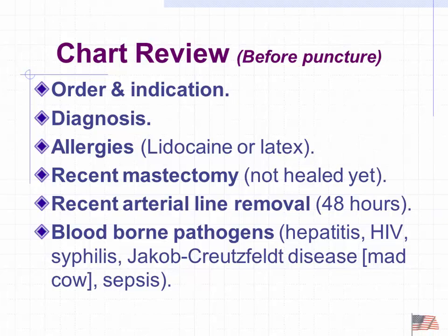Do they have any allergies? If we're going to use lidocaine as a pain suppressor, need to find that out. Latex, as far as latex allergies, most of the gloves that we use are not latex based, so it's not as much of an issue. Have they had a recent mastectomy that has not been fully healed? Because as mastectomies affect the lymphatic system, it really more pertains to venous sampling than it does arterial sampling, but usually we will not use the arm on which the mastectomy was done.